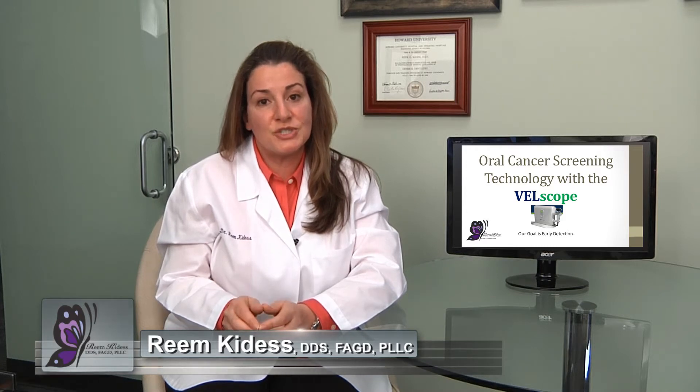Here in our practice we use a breakthrough technology called the VELscope, and here to introduce it to you and demonstrate it is our wonderful hygienist Tracy Goldman. Hi, my name is Tracy Goldman, I'm a registered dental hygienist, and I'll be introducing our oral cancer detection device to my patient April today.